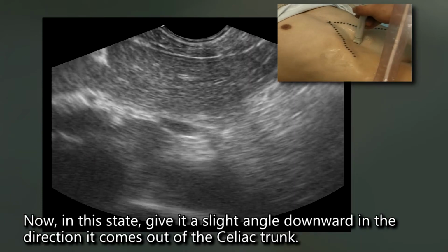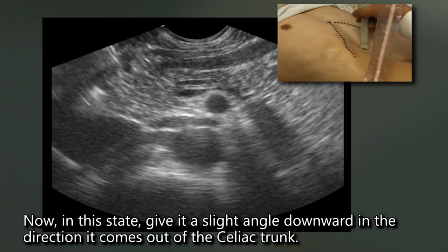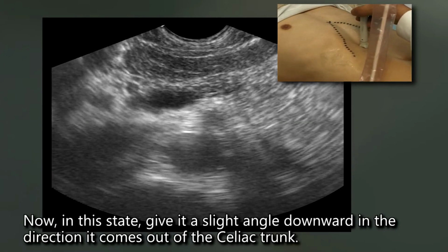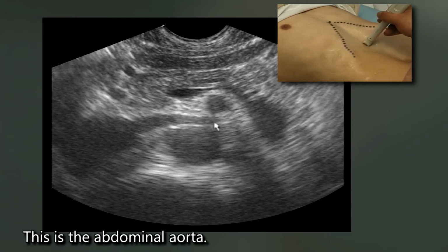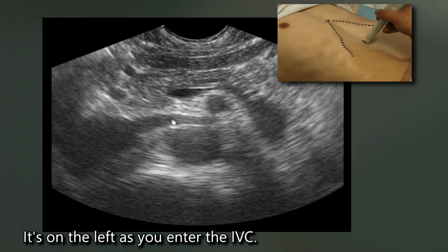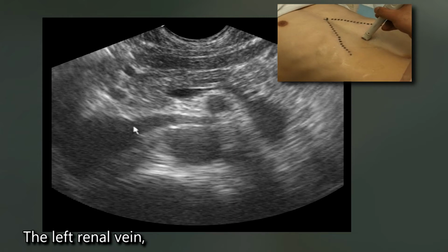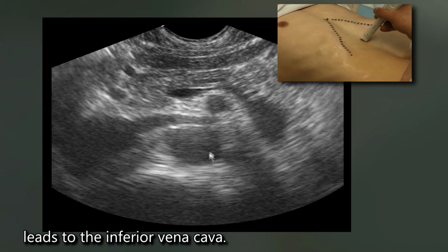Now, in this state, give it a slight angle downward in the direction it comes out of the celiac trunk. You can see the anatomy right behind the pancreas. This is the abdominal aorta. This is the IVC. The left renal vein, coming from the left, leads to the inferior vena cava.